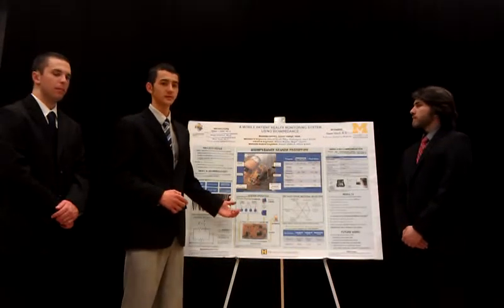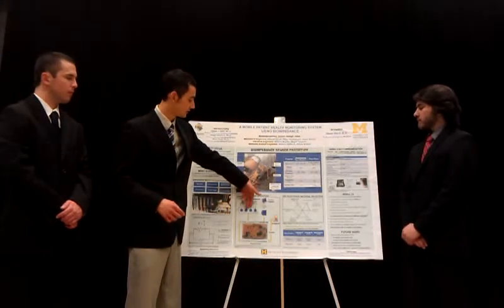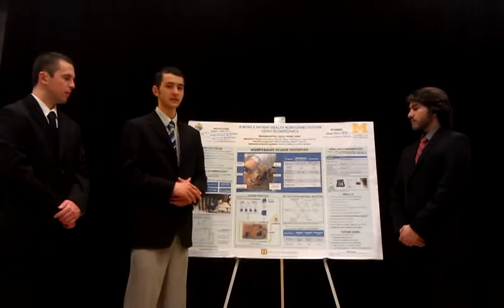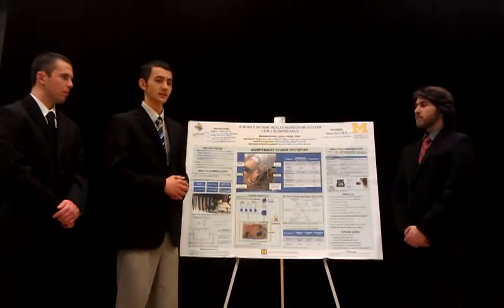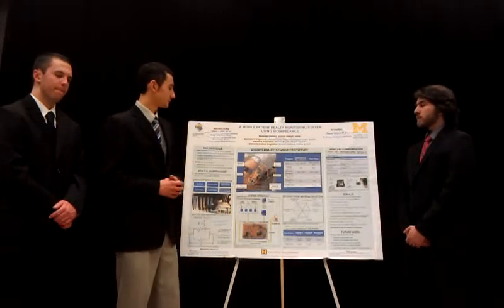Then we compare the voltage difference of the area of interest at the two inside electrodes and clean the data using a low-pass filter. After the data is cleaned up and there is no noise, the data is transmitted using XBee to the computer in order to monitor the vital signs.